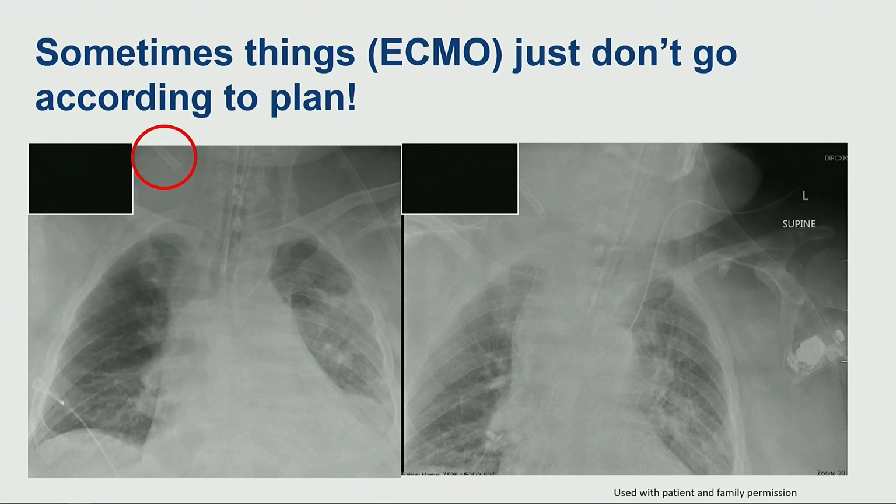Okay. So now I've highlighted it for you. That does look like a cannula that's almost out, right? And that does look like a hematoma in the neck and the mediastinum. And if you look at the other side, this looks way worse, right? So what happened is there was a mechanical event where the patient was turned over for a chest X-ray, and the cannula got displaced.